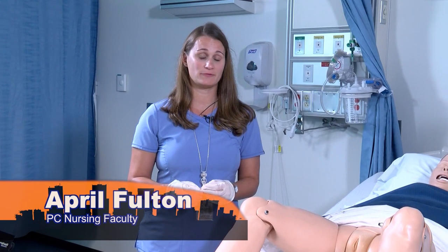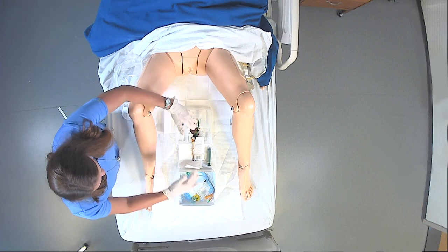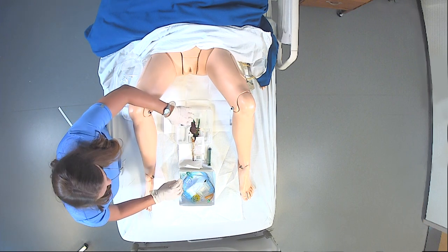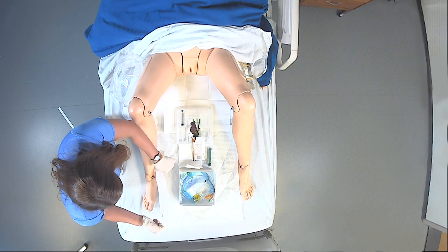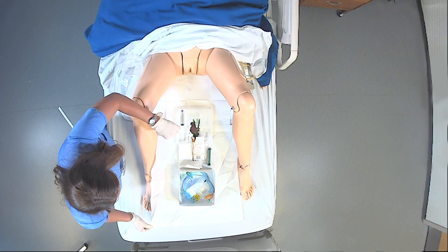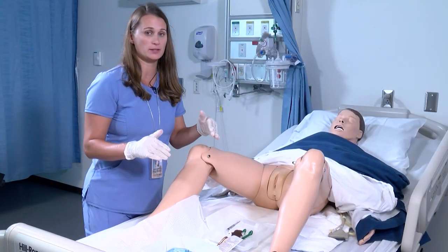Next I'm going to show you some common mistakes made when placing a Foley catheter and ways to avoid contamination. First I want to point out our sterile field. We have two drapes down and the biggest thing is you want to make sure that you maintain sterility of these drapes. You have a one-inch border which you can use to touch and adjust your drape if you need to, but you want to avoid moving it as much as possible.